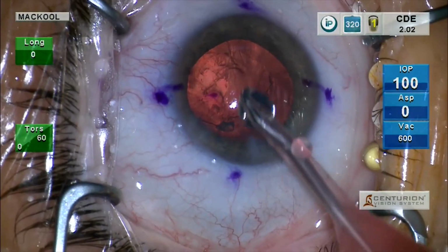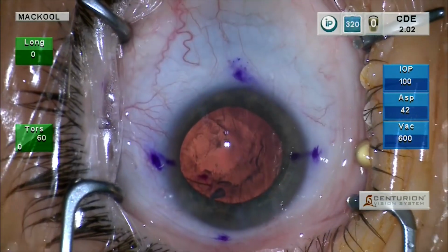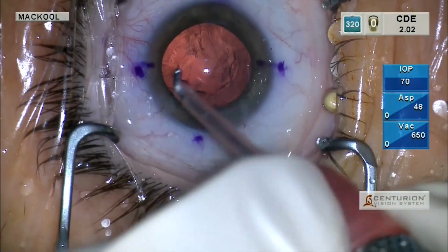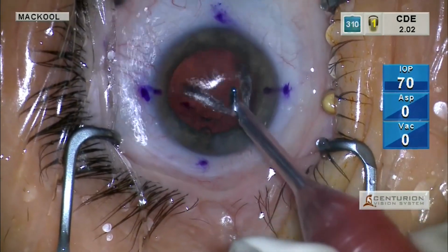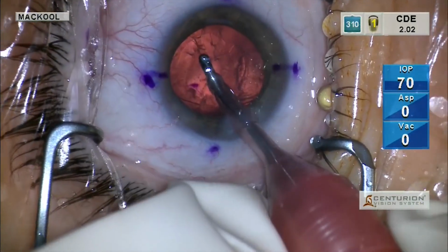Yes, there's a little piece of nucleus there, but that'll be easy to aspirate with irrigation aspiration in just a minute. The next step is to insert the I/A tip. So testing infusion, it's good. This is a 90-degree I/A tip with a 0.25 port.